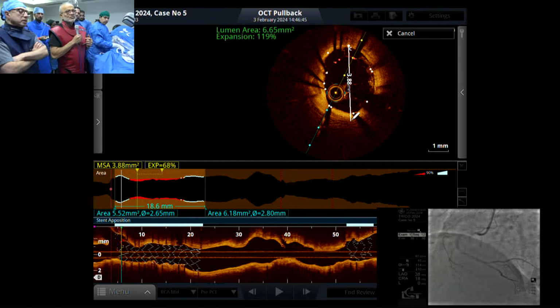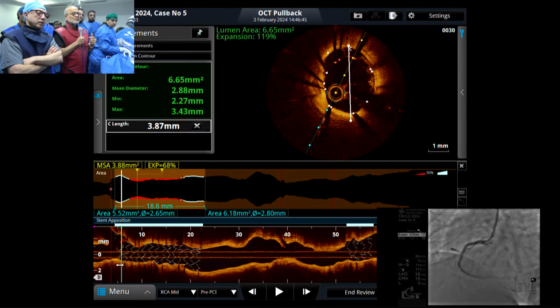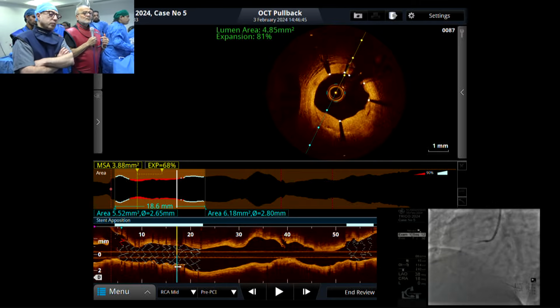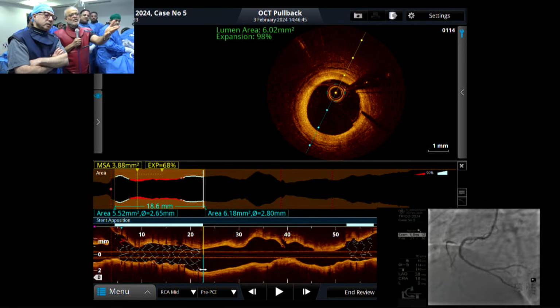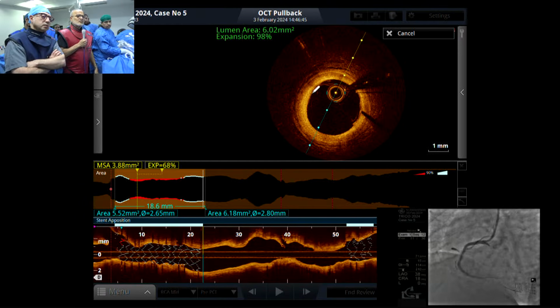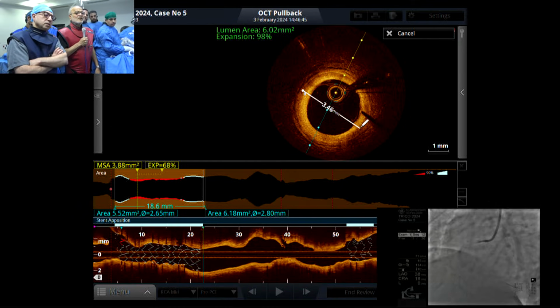And then go to the proximal edge of the stent and see what the reference diameter there is. Because maybe you can use a 3.5 and see if a short proximal balloon allows. Right there, what's the diameter here? It is 2.6 or something, 2.7. But how about EEL? If we don't see good EEL, you can see there.